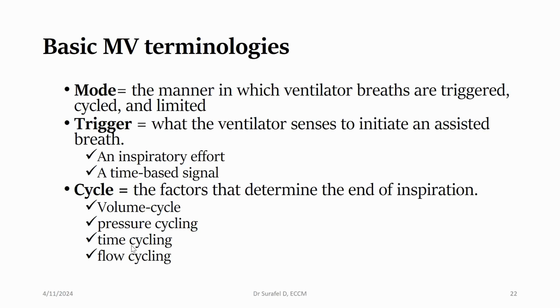So flow cycling and volume cycling are more or less similar concepts, because if you set the flow at a constant rate, then it will deliver a specified amount of volume. So volume and flow cycling are usually related concepts, but you can also have pressure or time cycling. We will see this on a graph. Okay.